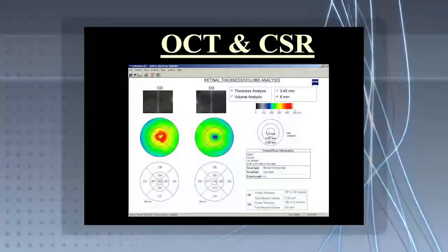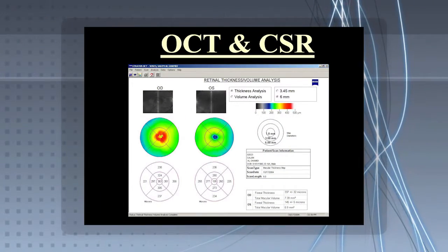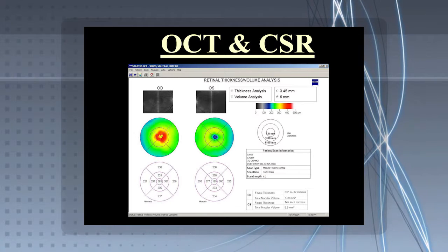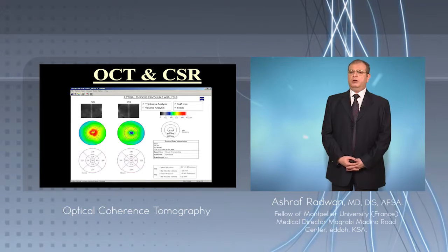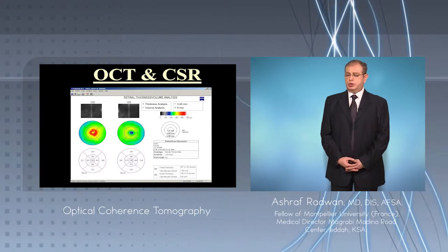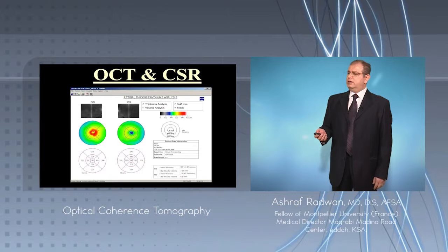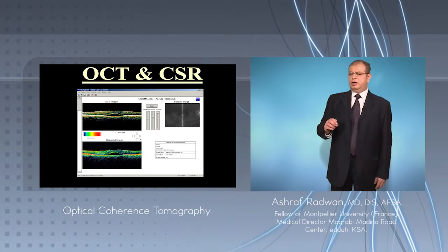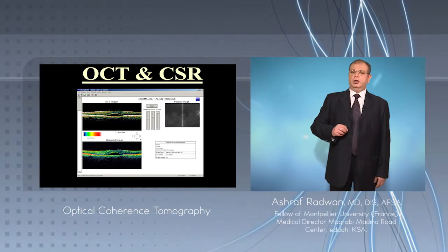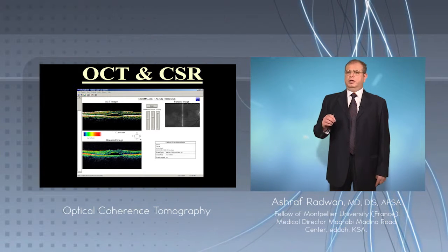As we see here in the OCT picture, there is an increase in the thickness of the fovea, which was not clear with the fluorescein angiography image. Once we did the cuts over the macula, we can see this subretinal subfoveal fluid correlating with the presence of CSR.